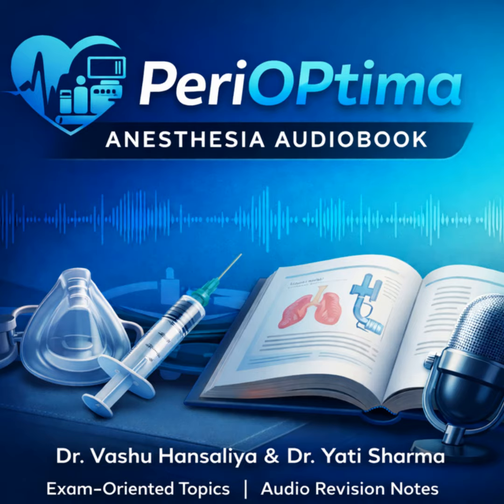What are the must-know basics? Frequency. That has to be the starting point. Sound is a mechanical wave. Ultrasound is anything above 20,000 hertz, which is the limit of human hearing. But Morgan points out that for medical imaging, we are way, way higher. Millions of times higher. We're talking 2 to 15 megahertz.